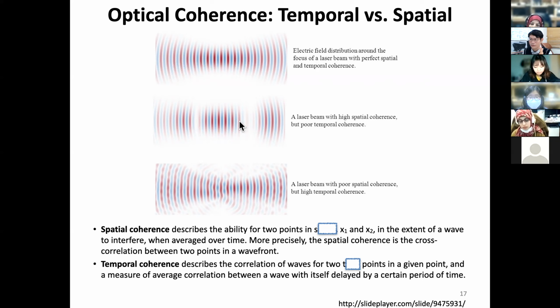So you can't really find the phase relationship between this and this while the laser beam is propagating. So at different time points, this will be smeared. So what it means is this has a poor temporal coherence, because we are looking at this as a propagating wave. However, in the perpendicular direction, at one point, ups and down, you see these are perfect, a very nice relation. So that means spatially coherent light.